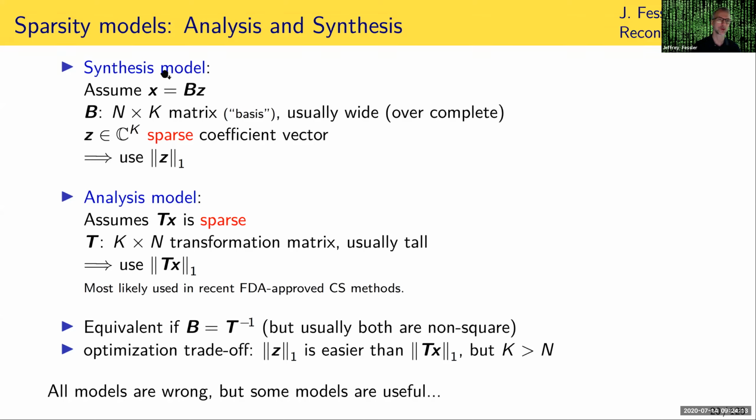It's very debatable whether any real world images in MRI actually satisfy this model exactly, but if you're going to undersample k-space data, you have to impose some kind of model to make up for the missing data, and the models on this page are two of the models that have been used effectively to reduce the degrees of freedom somehow in the reconstruction problem.